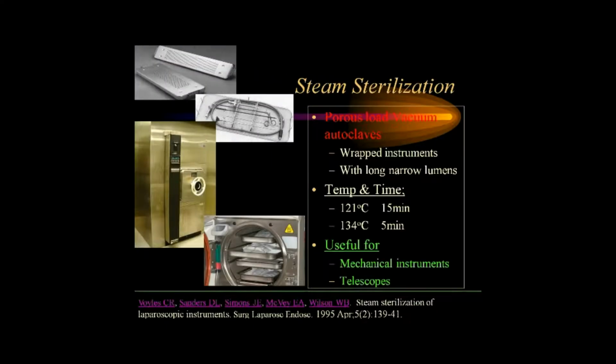Next slide. Coming to steam sterilization, the autoclave is by far one of the commonest modes of sterilization for open equipment, but even for laparoscopy, especially all the mechanical instruments like most of the trocars, hand instruments, even telescopes, can be easily and safely sterilized.